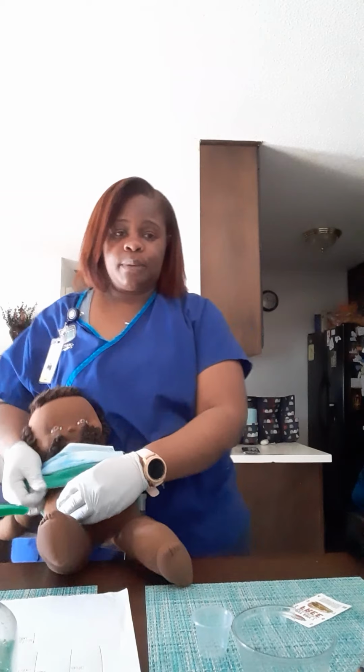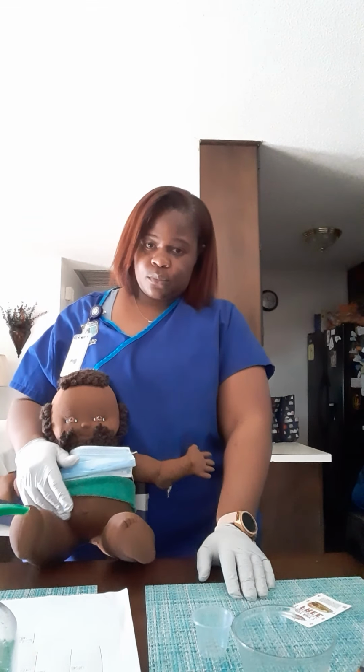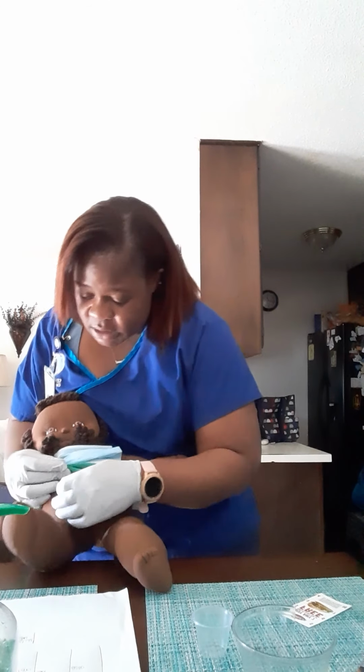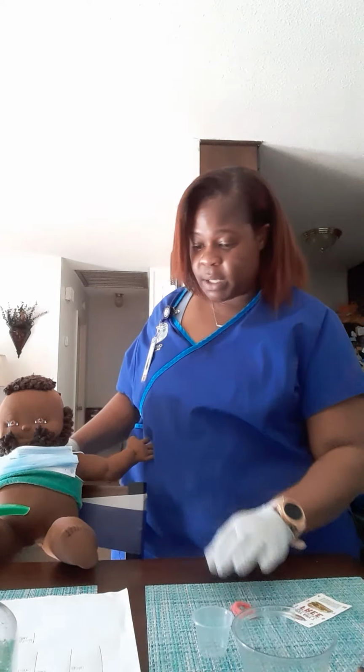And now I take a cotton ball, just in case there's any drainage or bleeding, but I would check the injection site for any redness, any infection, or any kind of reaction to the injection. Okay, the patient, the skin looks good. Pull his gown back down.